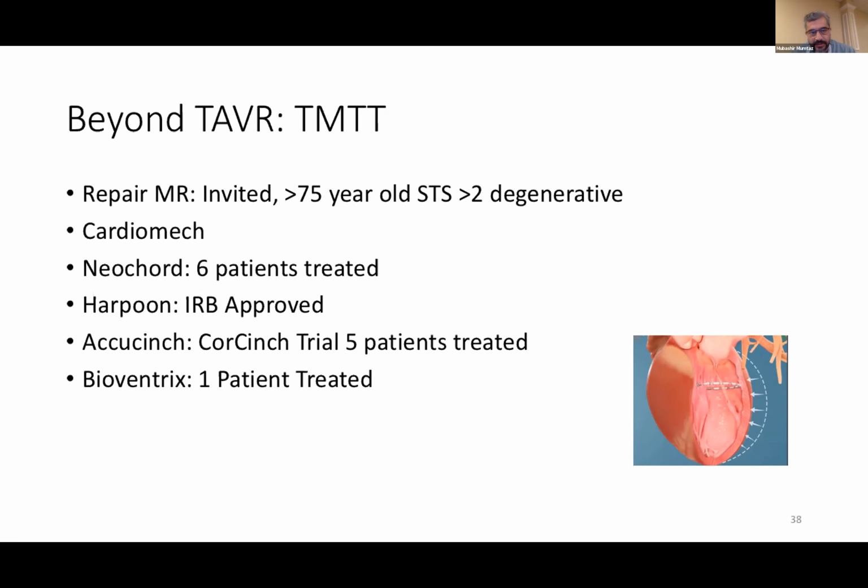We've done 5 cases, and we recently did anterior apical aneurysm plication in a patient using BioVentrix technology, which also is great and worked out very well for us.